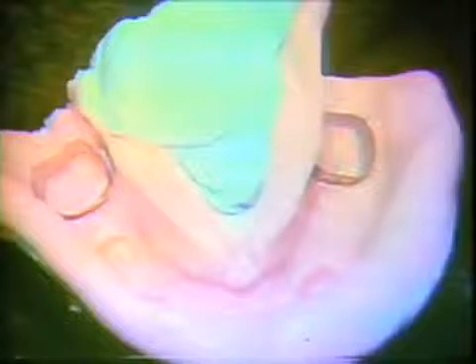This first slide demonstrates the application of the separating spring prior to fitting the first band. The second slide shows the impression with the placement of both bands and the attachment, the lingual sheath attachment, prior to pouring the model.